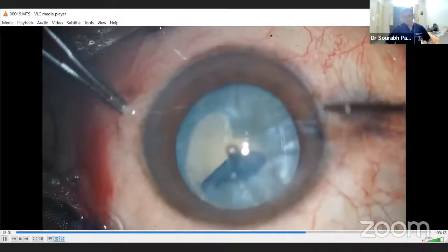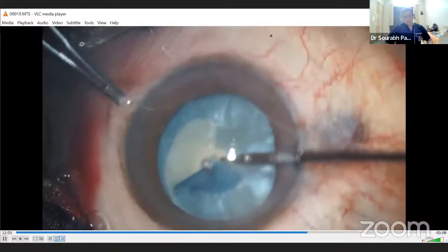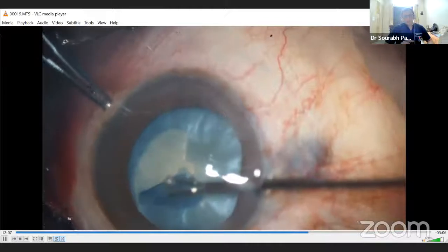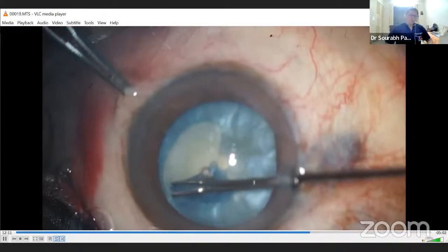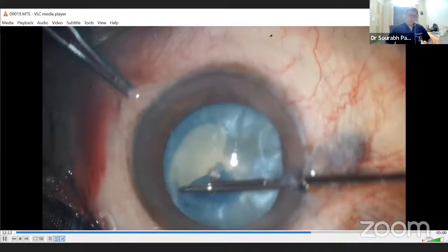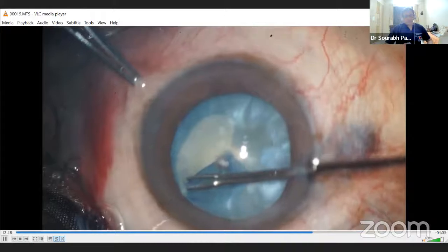Yeah. So basically in quick pull, you have to be really quick. If you are slow, that means it is going to extend for more arc. So like here, you have to quickly pull it inside. The speed has to be like a jerk.